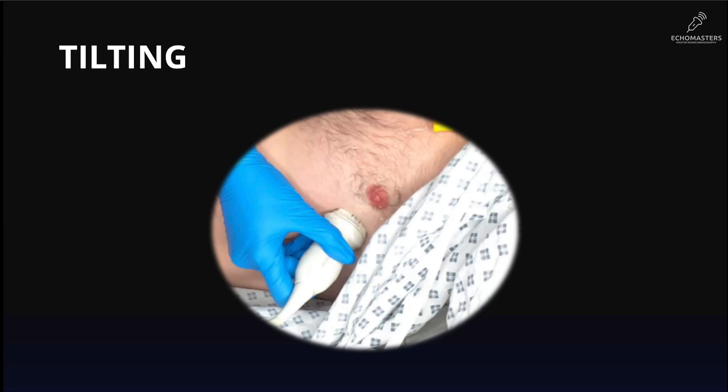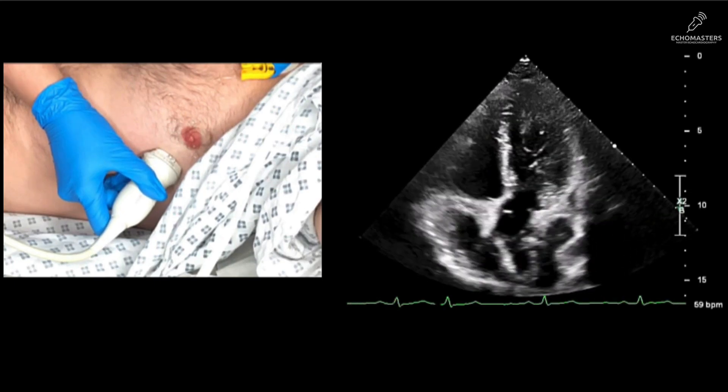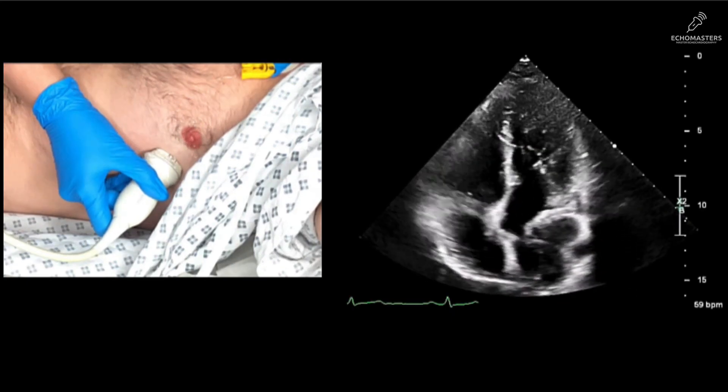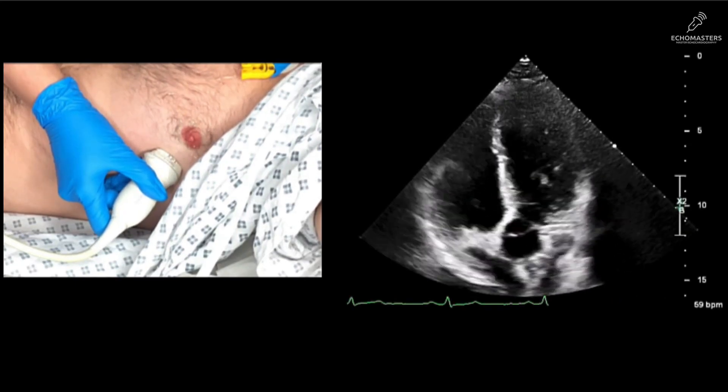Next up is tilting. Imagine holding a flashlight: your hand stays still, but you aim the beam up and down. That's exactly what tilting is — a very tiny, fine movement. The probe's footprint stays in the exact same spot on the skin, but we angle the beam to scan through the heart. A classic application is from the apical four-chamber view, where a tiny tilt of 10 to 15 degrees by lowering the tail of the probe down aims anteriorly, opening the aortic valve and the LVOT — moving from apical four-chamber to apical five-chamber view.